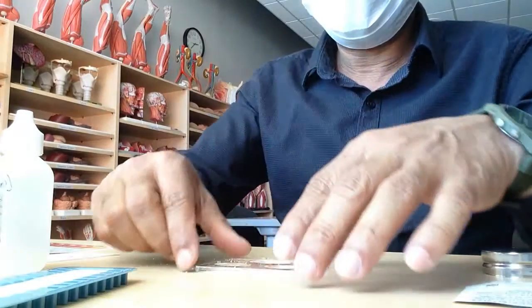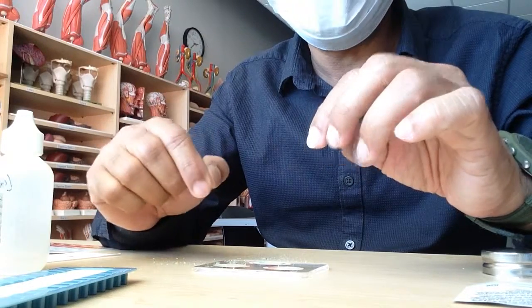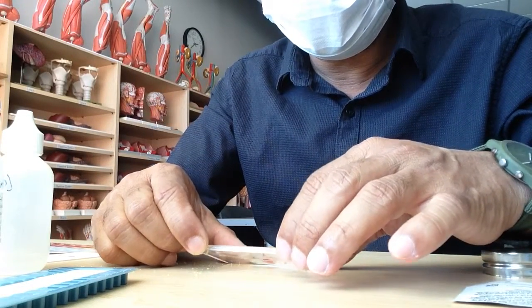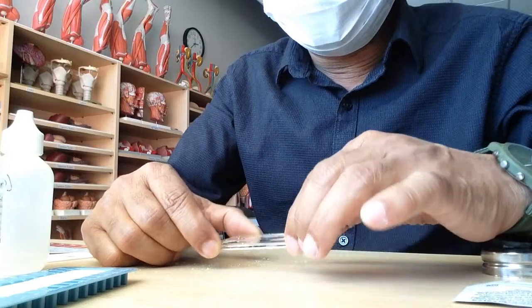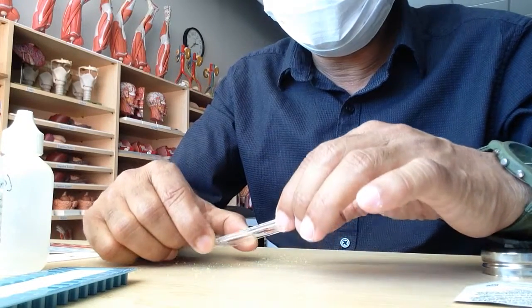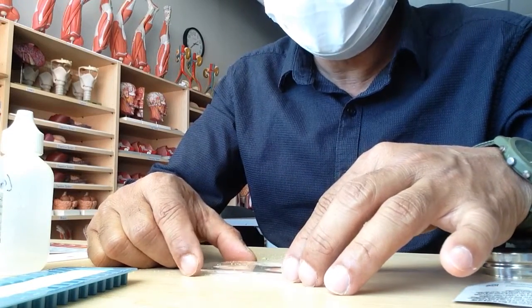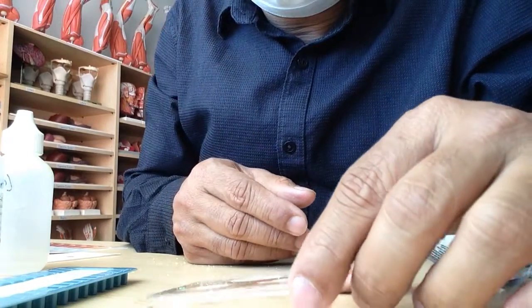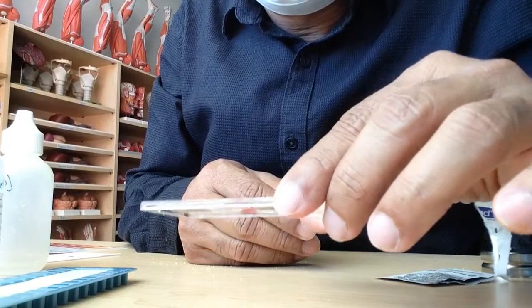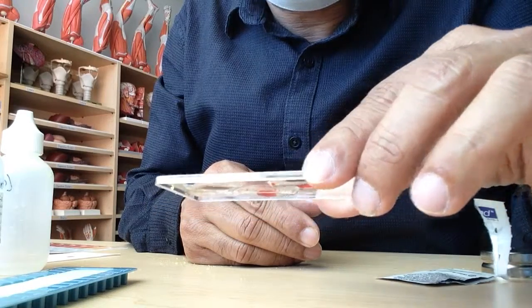And RH is to determine if the blood is RH positive or negative, plus or minus. So if you see any clumping in RH, then it is positive. And if you don't see any clumping in A or B, but clumping only in RH, that means O positive. So here I see clearly blood clot has been formed in RH well, but no blood clot in A or B. So that means the blood type is O positive.